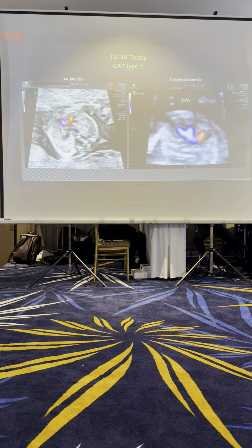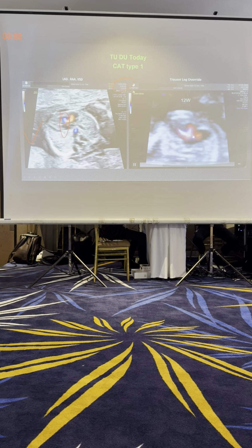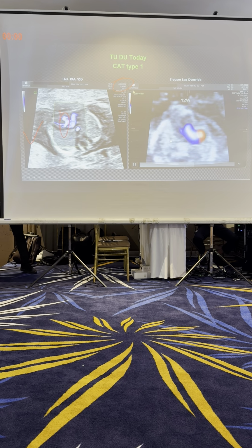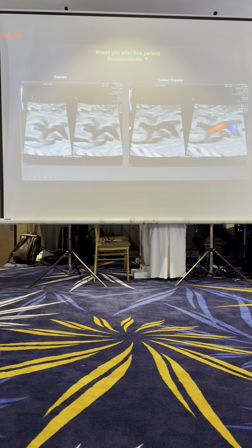I then see that there's a VSD. I then look at the STIC volume acquisition and I can appreciate that the aorta is sitting astride the ventricular septum. So this is a baby who's got a common arterial trunk type 1 in the first trimester of pregnancy. And I've already mentioned the other types of common arterial trunk.